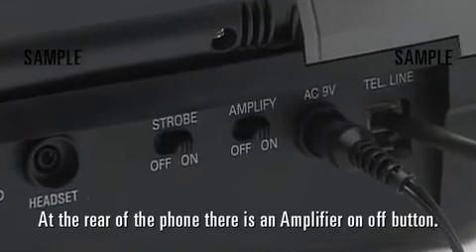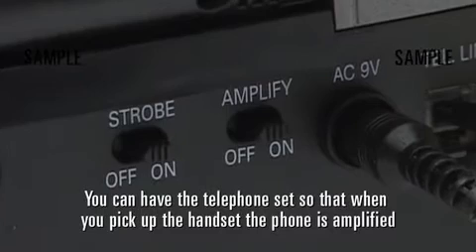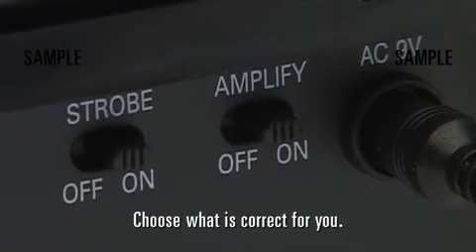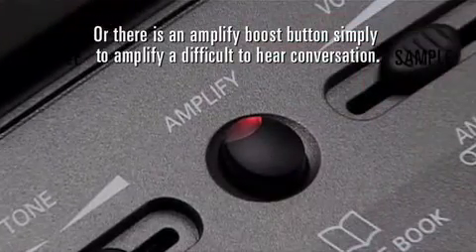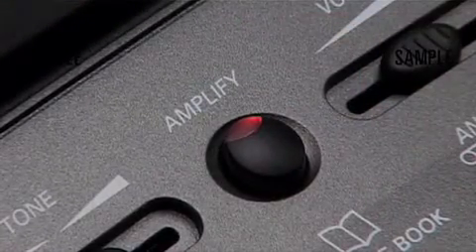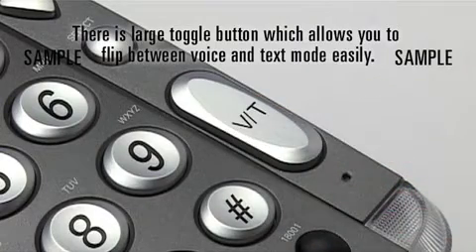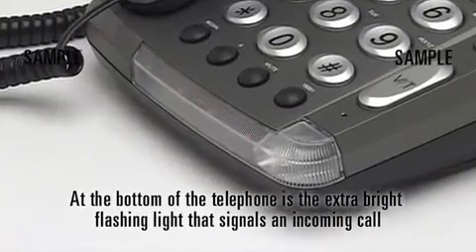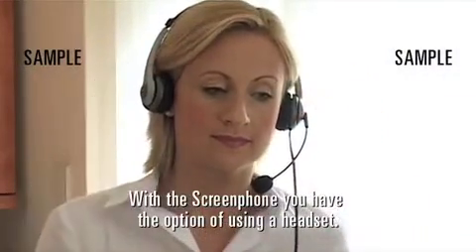At the rear of the phone there is an amplifier on-off button. You can have the telephone set so that when you pick up the handset the phone is amplified, or you can have it set at regular volume — choose what is correct for you. There is also an amplify boost button to amplify a difficult-to-hear conversation. A large toggle button allows you to flip between voice and text mode easily. At the bottom of the telephone is the extra-bright flashing light that signals an incoming call. With the ScreenPhone, you also have the option of using a headset.